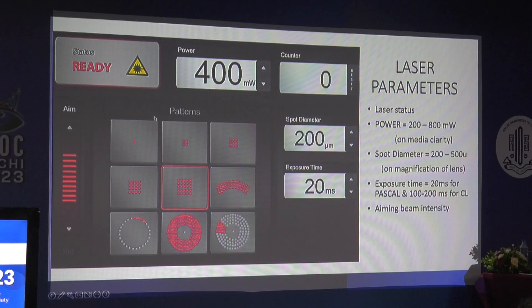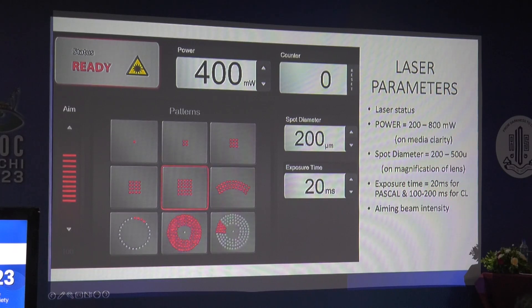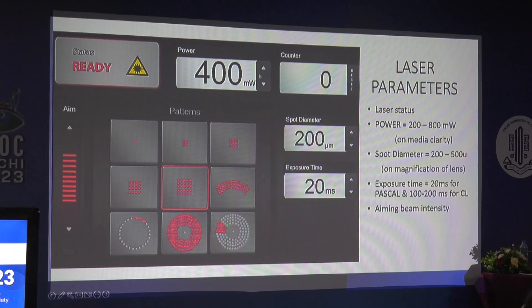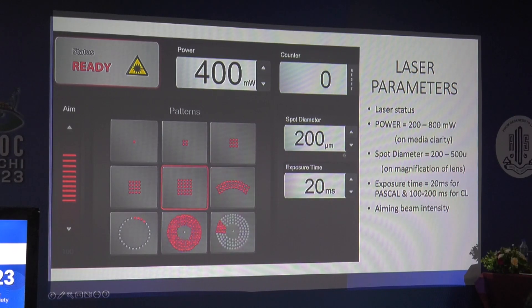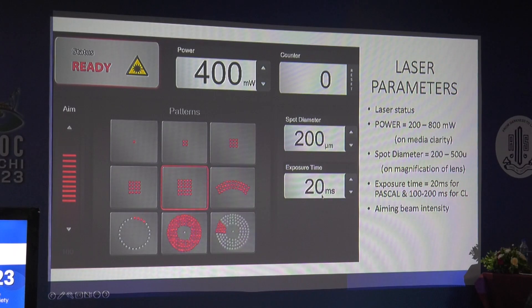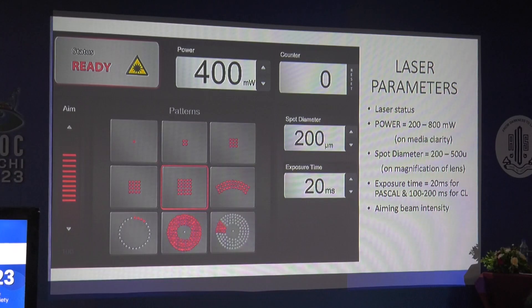This screenshot is taken from a Pascal laser showing the parameters. First, the status should be ready before your laser. Power for Pascal is around 400 milliwatts; for conventional laser it is around 200 to 300 milliwatts. Spot diameter most commonly used for PRP is 200 microns. Exposure time is shorter for Pascal at around 20 milliseconds, compared to conventional laser at 100 to 150 milliseconds.